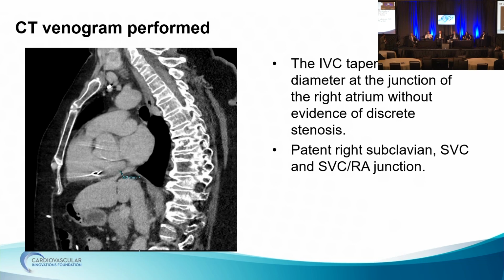So you think about switching to IJ? Yeah. Who would switch to IJ here? Yeah, this is going to be tough, I think, going from the femoral. I haven't closed an ASD or PFO from the IJ, but I think it's obviously doable. So that's probably what I would do. Do it from the left subclavian. The ergonomics relative to the IJ would be a little easier. You put the table out off the left shoulder. Have done that a few times.